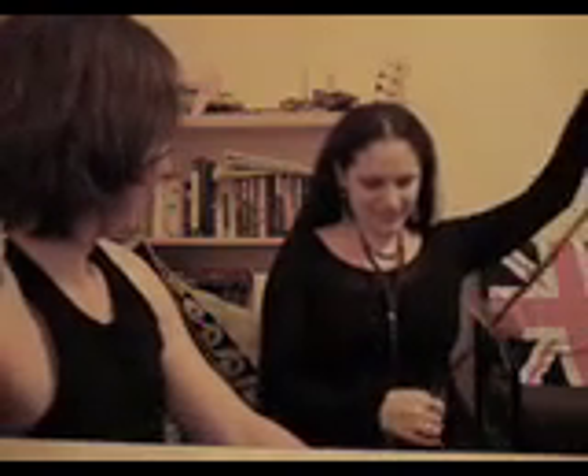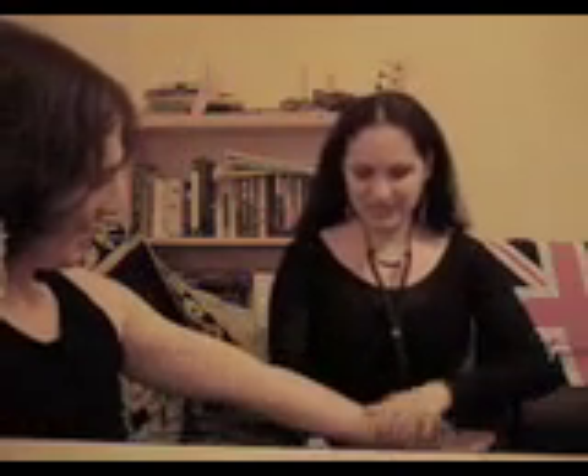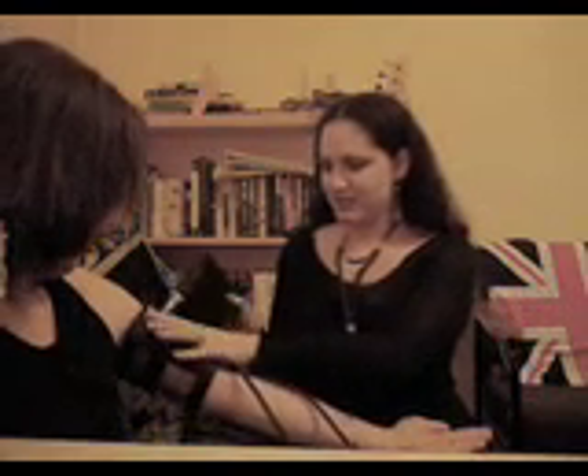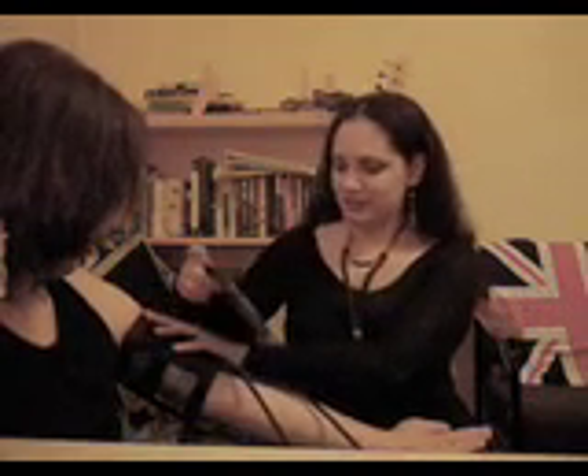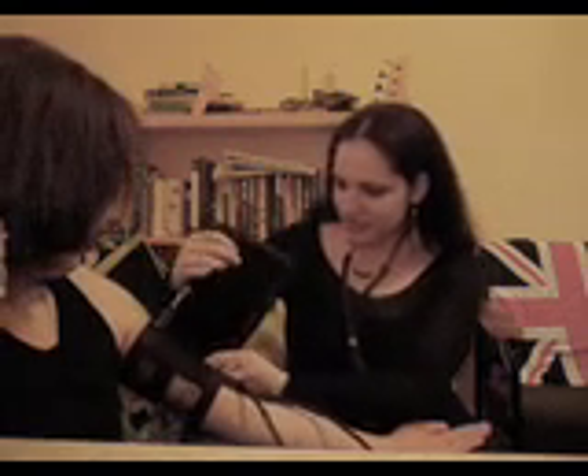Palm upward — that's your hand here. Unfortunately, Phil has a really strong heart so taking his blood pressure is really easy.